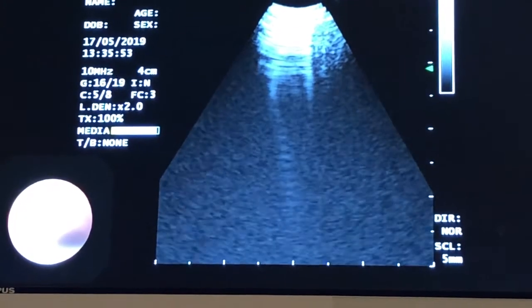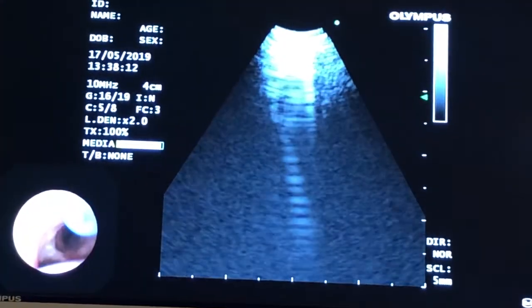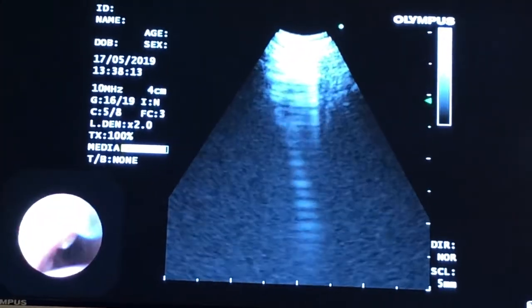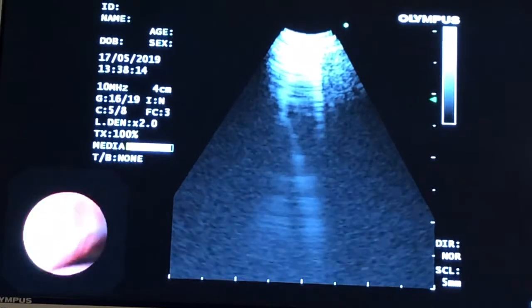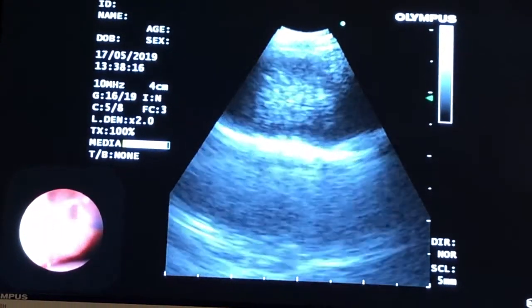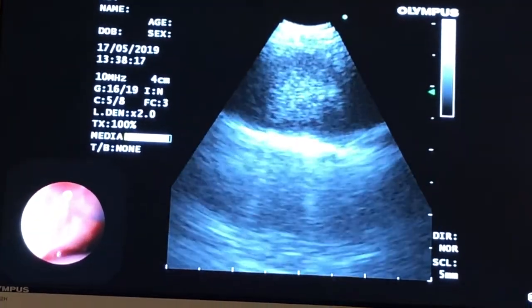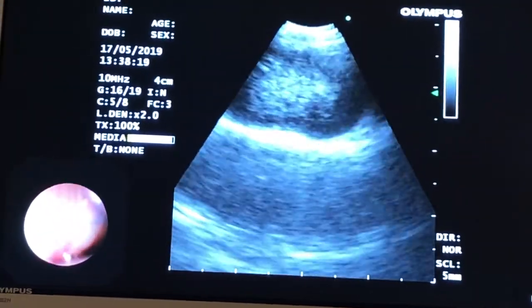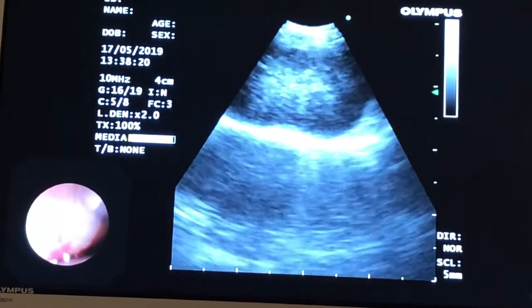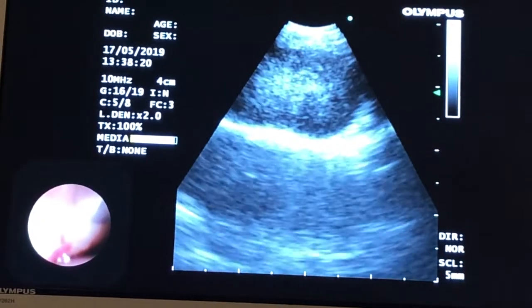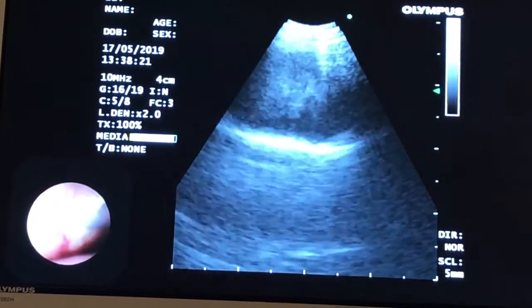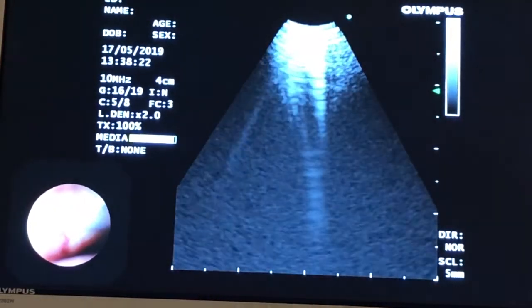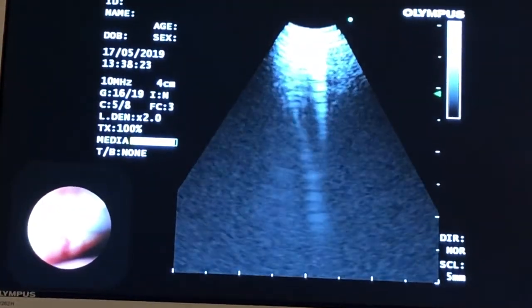So we'll be able to biopsy the lesion through EBUS TBNA as well for additional tissue. Here we are with the needle now. We're back to that 4R lymph node station, just about to place the needle into that lymph node.